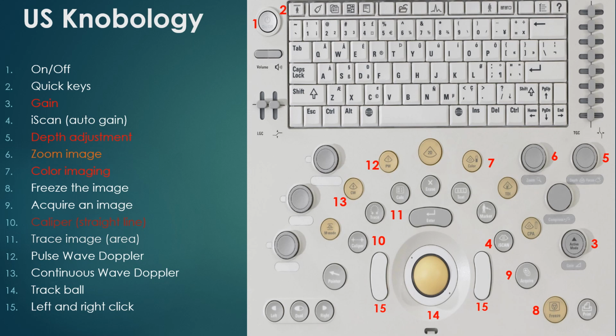The caliper is very, very useful when you're measuring the IVC, or the walls of the LV or the walls of the RV or the chamber, just to get an idea about whether or not the heart is large. Instead of just eyeballing things, you can actually measure these, and there are several nice little apps that you can put on your phone. You can very quickly dial up what the appropriate size chamber is and get an idea about ventricular hypertrophy, for example, whether it's chamber or wall hypertrophy. So again, this is the simplest console in the world. This is the Philips CX50, which is more like a laptop computer.